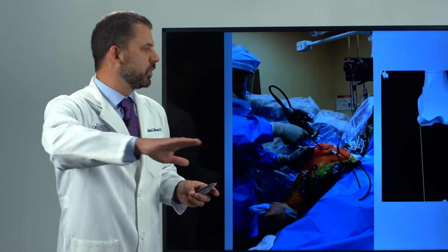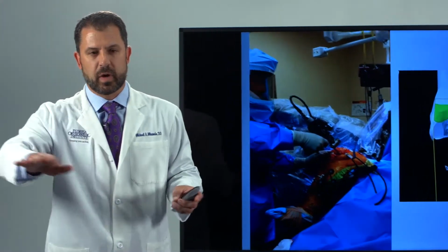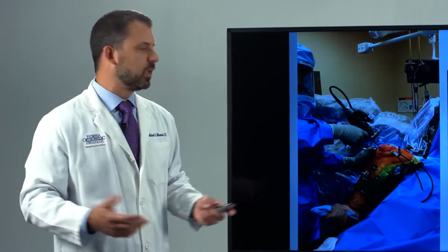So if you try to push it too far to the right or too far to the left, it's based off of a haptic system and it won't allow you to go too far to the right or too far to the left. So it's very safe too. You're protecting your ligaments and vital structures in the knee around it.